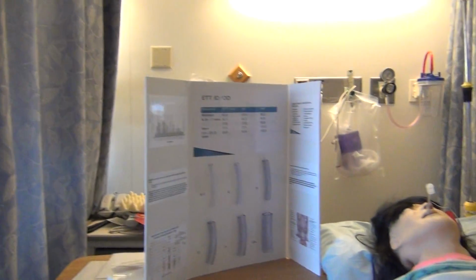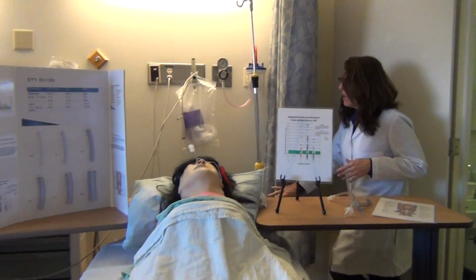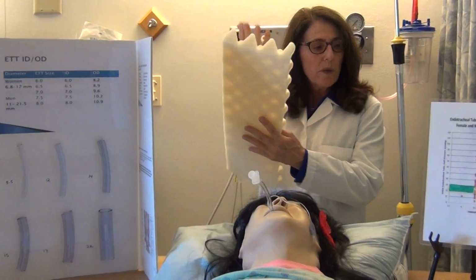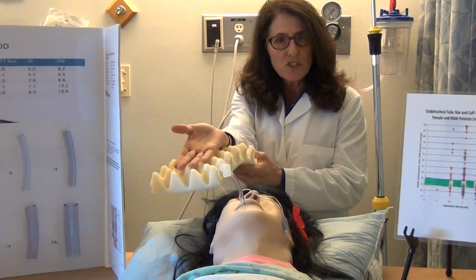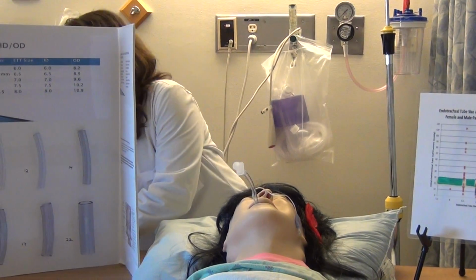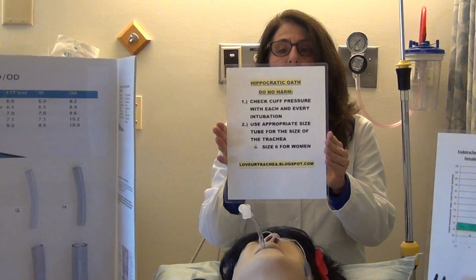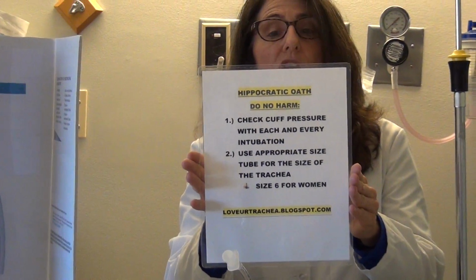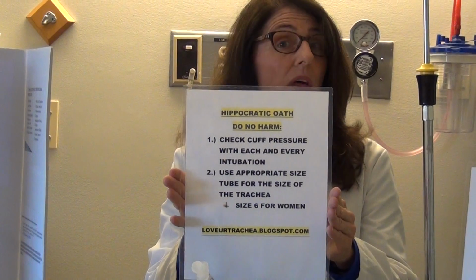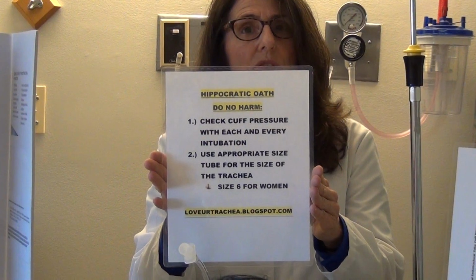So I want to end this talk about patient safety again and the Hippocratic Oath. First of all, what we do is we pad and protect the patient's extremities with each and every surgery, and we must do that for the patient's throat too. And I want you to remember the Hippocratic Oath. First, do no harm. Check cuff pressure with each and every intubation with a cuff manometer. And 2, use the appropriate size tube for the patient's tracheal diameter.